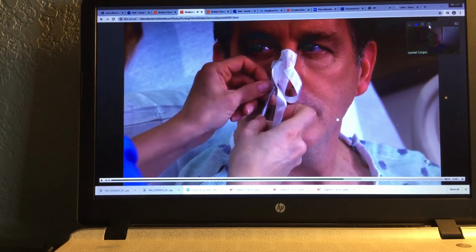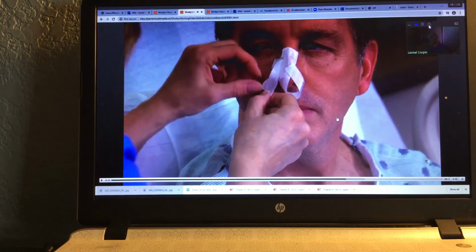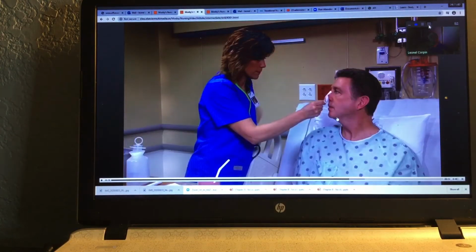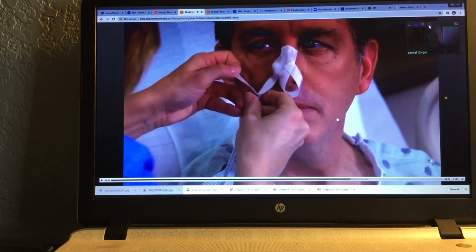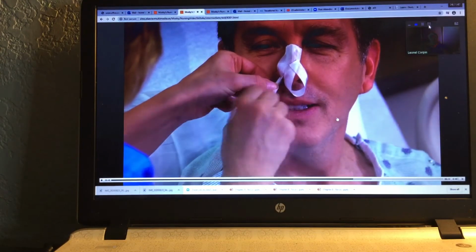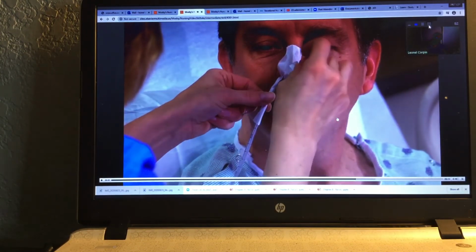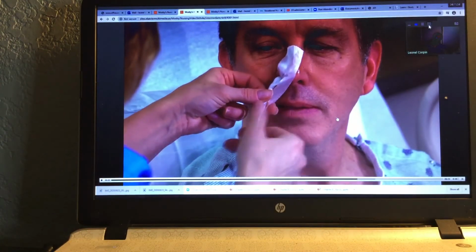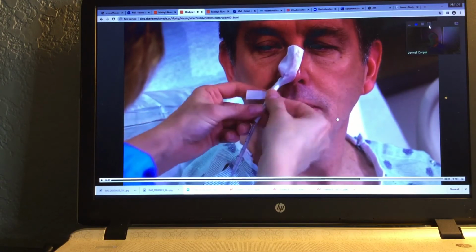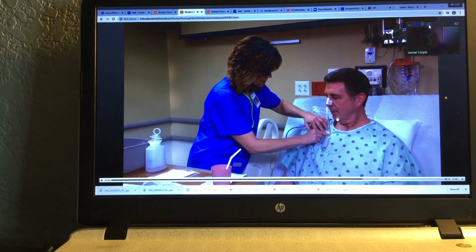Okay. Carefully take this old one off. Thank you for holding so still. Wrap each split end in opposite directions around the tube where it exits the nose. All right, now the other side here. Another smaller piece of tape may be applied over the bridge of the nose. Just like that.